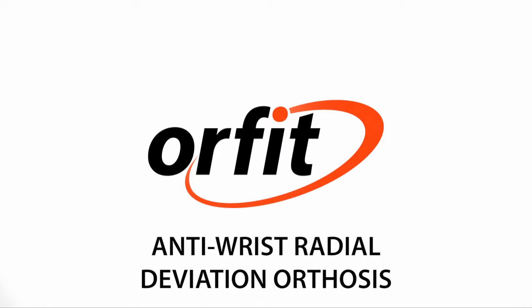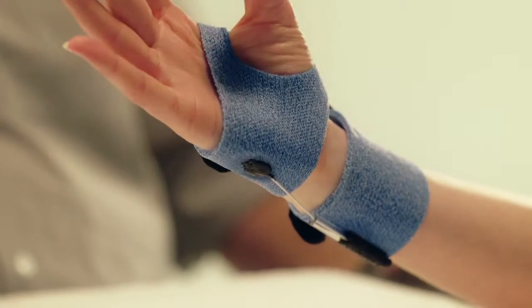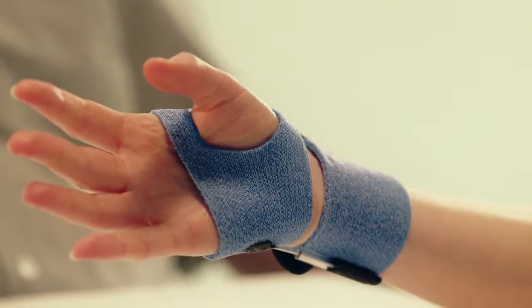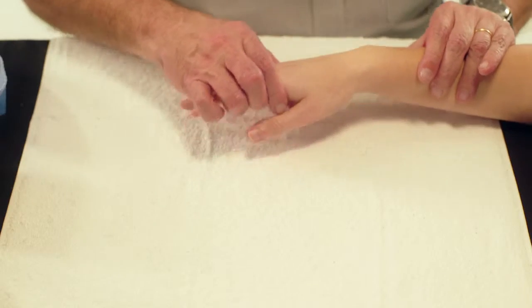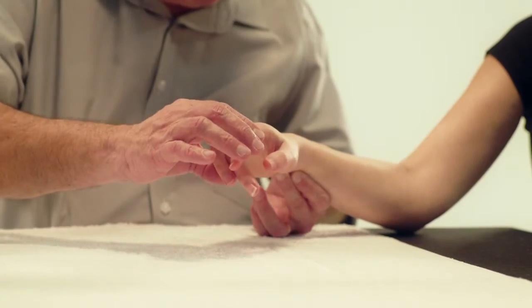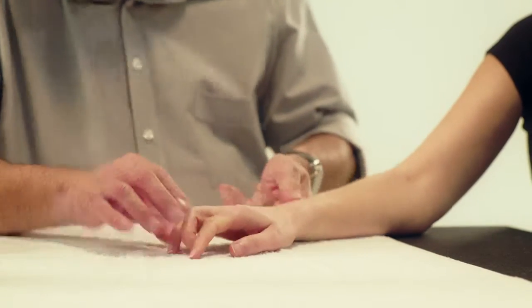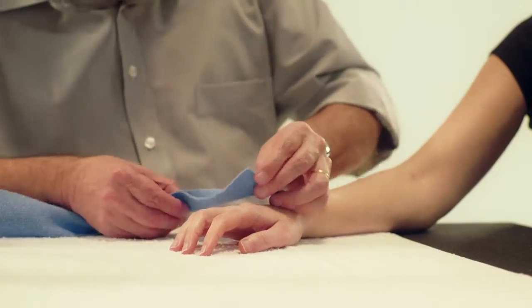Anti-wrist radial deviation orthosis. Here we will demonstrate how to fabricate an anti-wrist radial deviation orthosis with a dynamic pull on the ulnar side, used for example in case of rheumatoid arthritis of the wrist. To fabricate this two-portion orthosis, we will need two different pieces of Orficast.